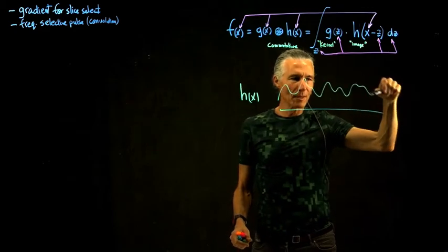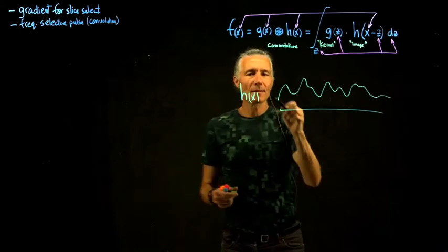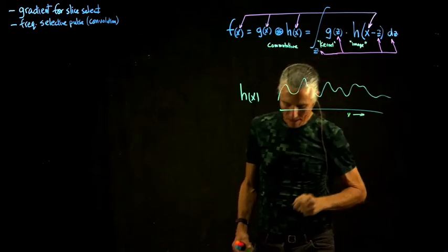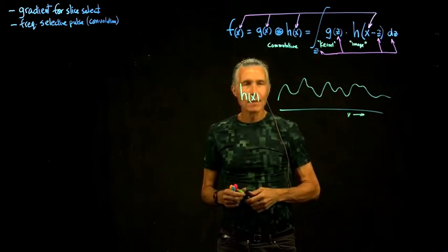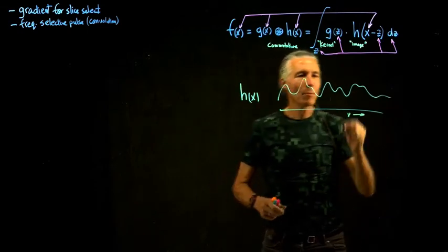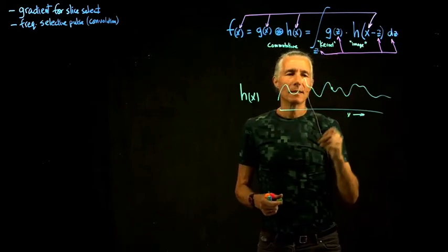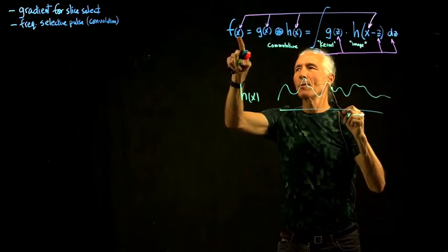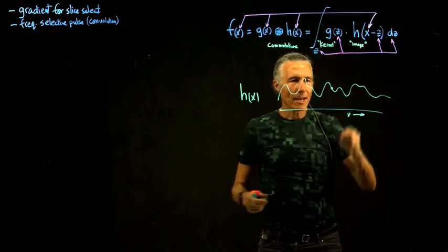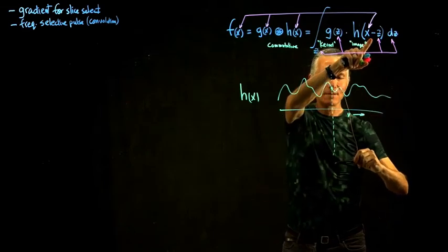It's just a one-dimensional function. So there's our image like that, this is our h of x, and this is x going in this direction. So now we take our function g, and what we want to figure out is for a particular point in x. So here's a particular point in x. That's a single point in x that we're going to run this calculation for. So how do we do that? For that particular point in x, what does this part of the equation mean here?